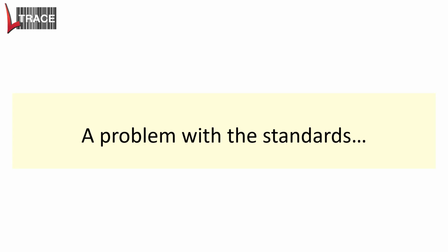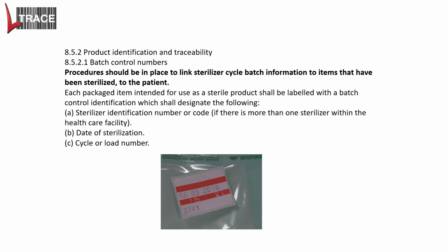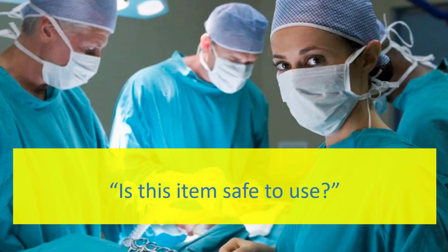Now, before I get started, I just want to talk about a problem with the standards. Well, first of all, apart from the fact that the standards will put you to sleep, what I wanted to do is look at what specifically the standards were trying to achieve. So within the standards, you see procedures should be in place to link sterilizer cycle batch information to items that have been sterilized to the patient. This is intended to answer one question and one question only, and that question is: is this item safe to use?